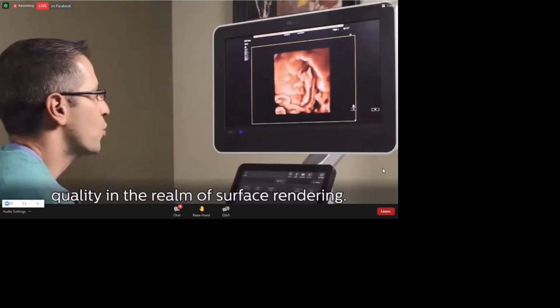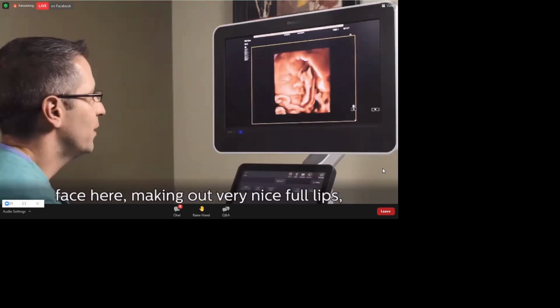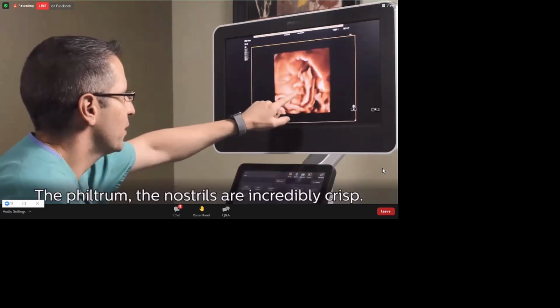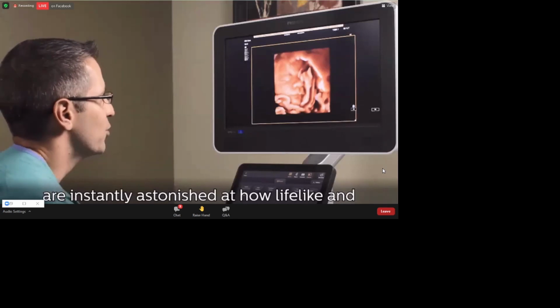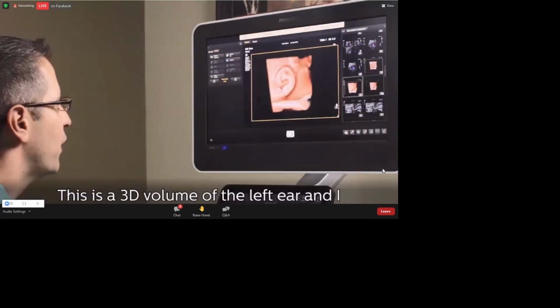Amazing and incredibly superb image quality in the realm of surface rendering. You can see this true view image of the fetal face here, making out very nice full lips, differentiation of actually even the shadowing of the upper and lower lips, the philtrum, the nostrils are incredibly crisp. Patients, families, look at these images and are instantly astonished at how lifelike and photorealistic these images are.